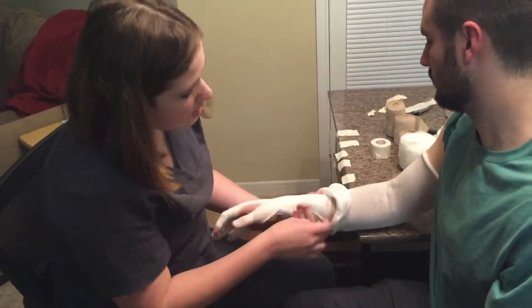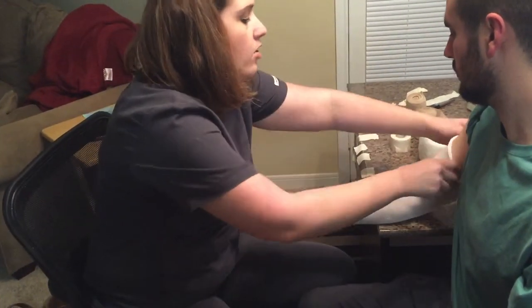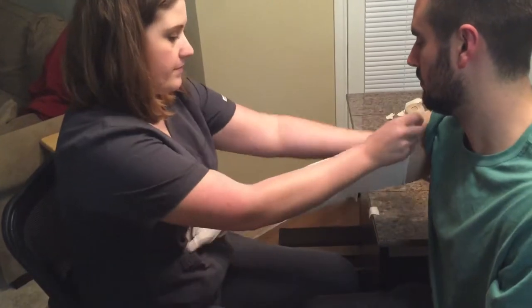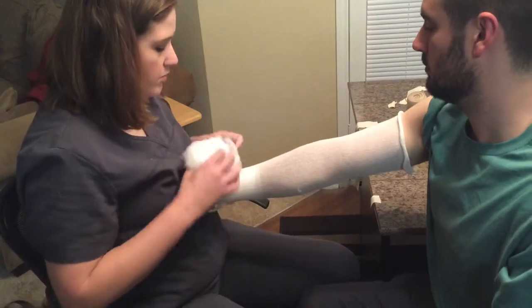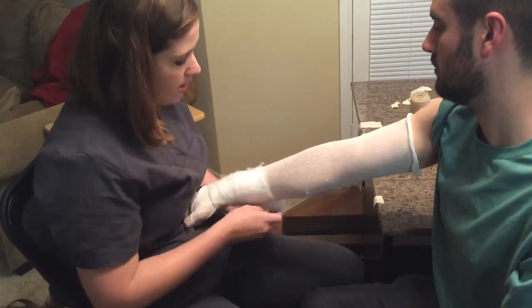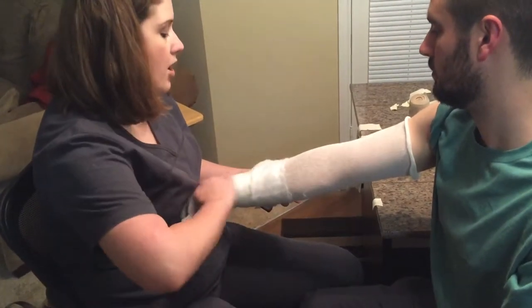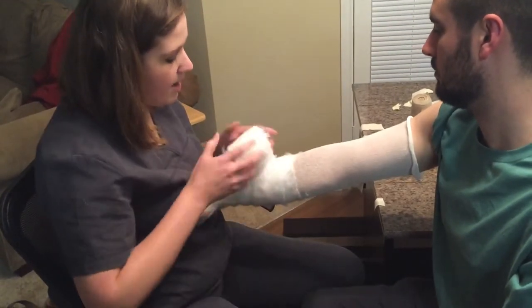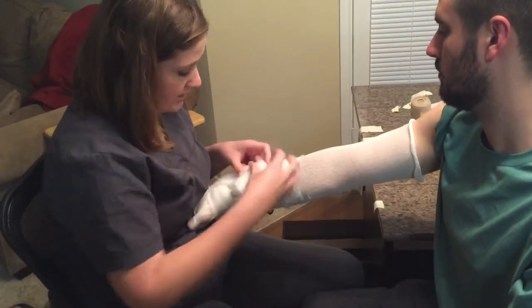Pull this down. If you need to tape that at home you can, but normally it kind of sticks to itself. At home when you're doing it by yourself, you may need to. The next step is this foam right here. You don't have to worry about wrapping it tightly or pretty — this is really just to keep your arm evenly compressed. The bottom part of your arm is smaller, so you want to make sure that you make the bottom part of your arm the same size as the top part so that everything is compressed the same.